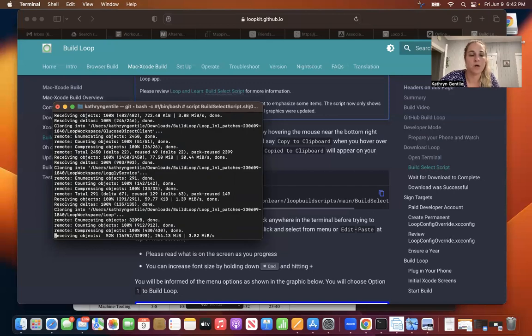Now, if you're watching this, what you could do, if you haven't done yet, it does automatically sign now. So if you haven't put in your team ID yet, you can go ahead and grab that from your Apple developer account. You should see it in the top right-hand corner, or if you don't, you have to click certificates and you'll see it down on that screen as well. Wait for it to load. I'm not going to show you how to do that because I don't want to show everyone my team ID, and I'm also not going to select sign automatically when it comes up, just so that again I'm not putting in my team ID, but I'll show you there where you would put it.